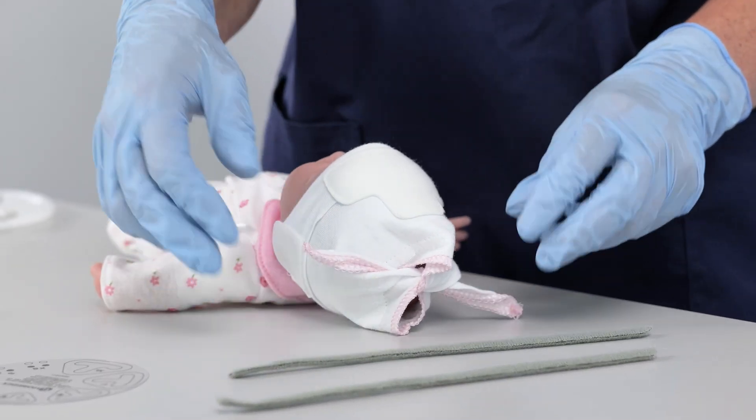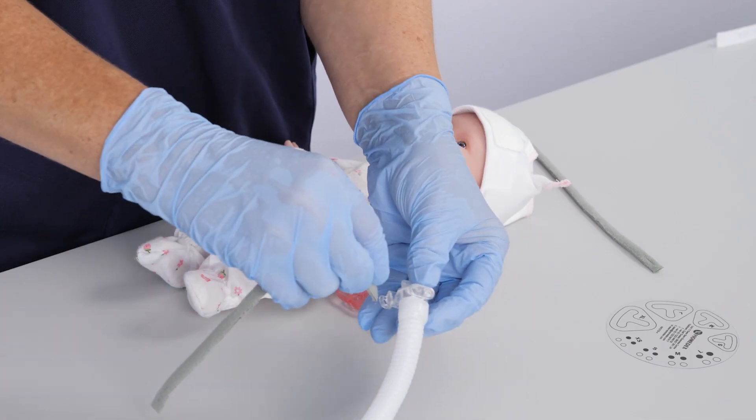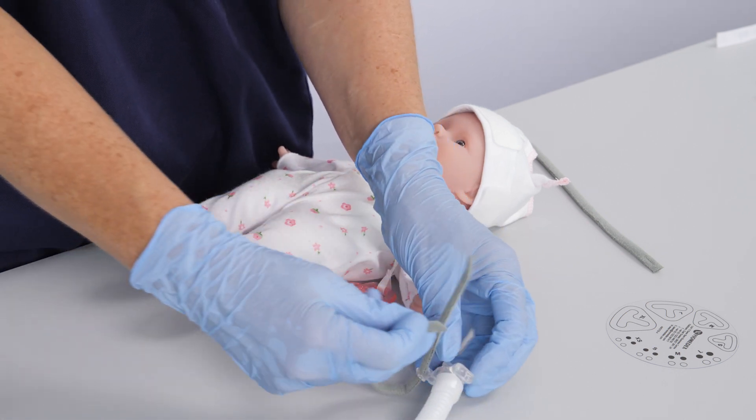Thread the grey ribbon through the generator on either side. Secure by pulling through the slit located on the other end of the ribbon, ensuring the knot is facing away from the patient.